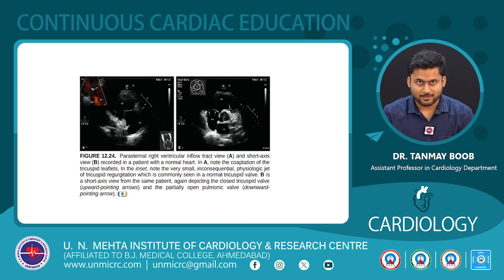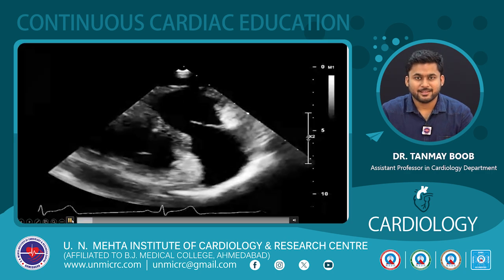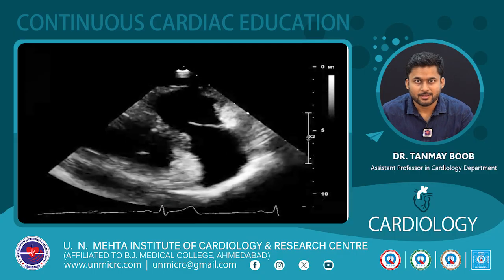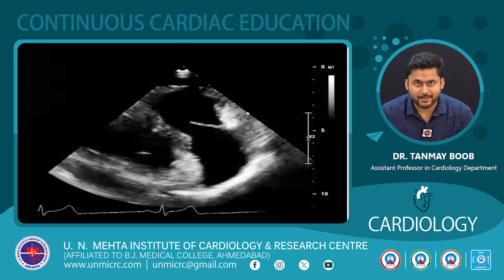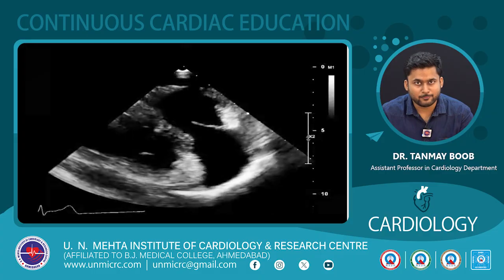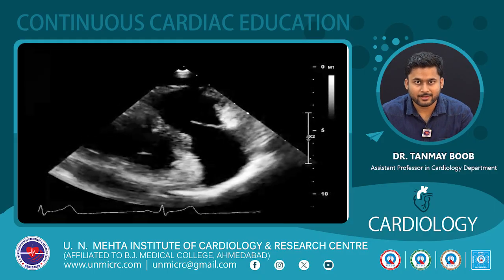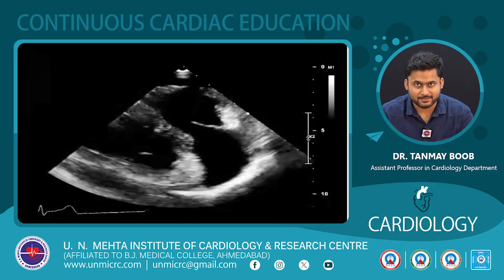As shown in the diagram, the first image, A, is the parasternal long axis RV inflow view showing two leaflets, anterior and posterior, while the second image, B, is the modified short axis showing the septal and anterior leaflets at the 9 o'clock position. The video demonstrating the RV inflow view is shown. The two leaflets of the tricuspid valve, the anterior and posterior, can be seen moving as shown in the video. And the RA, RV and opening of the IVC into the RA can be seen in this video.